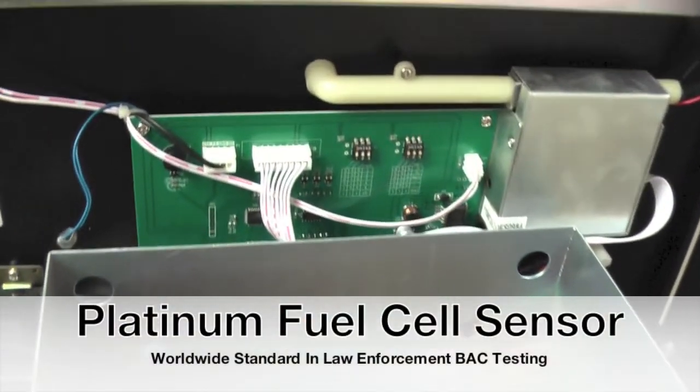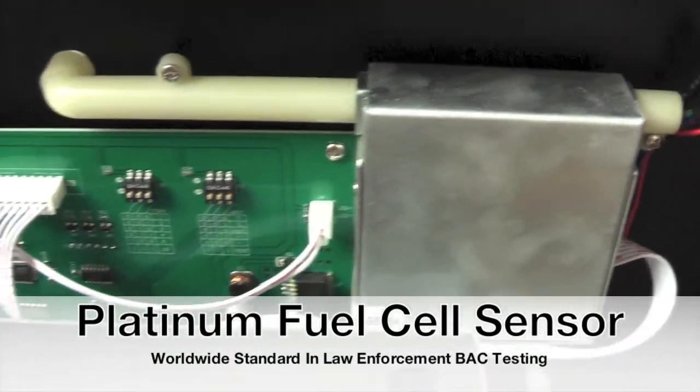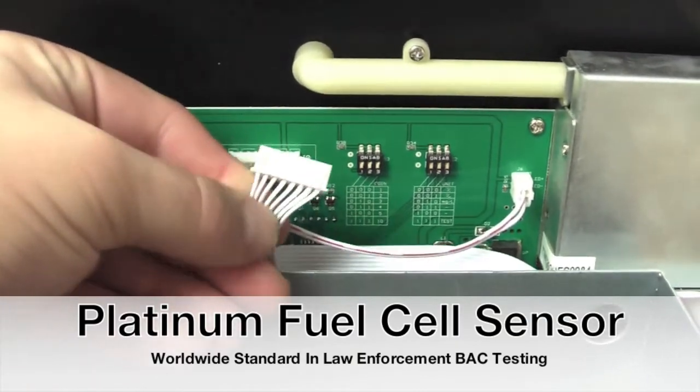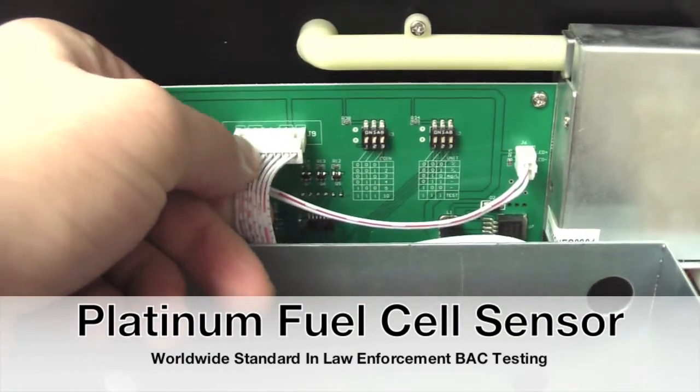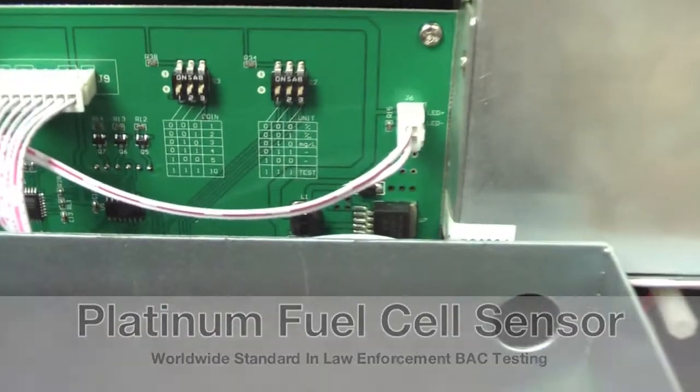Behind the straw dispenser you have the main PCB circuit board, and the platinum fuel cell sensor is a silver square module to the right. The platinum fuel cell sensor plugs directly into the circuit board with a ribbon cable. The fuel cell sensor can be swapped out in about 60 seconds with only a screwdriver.